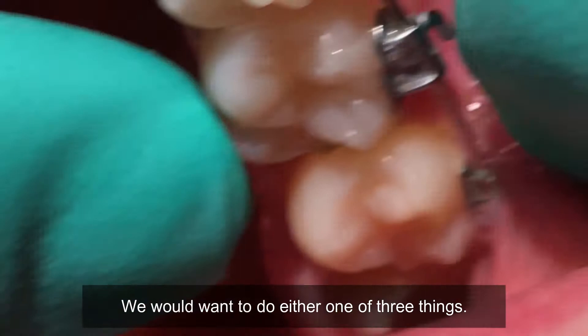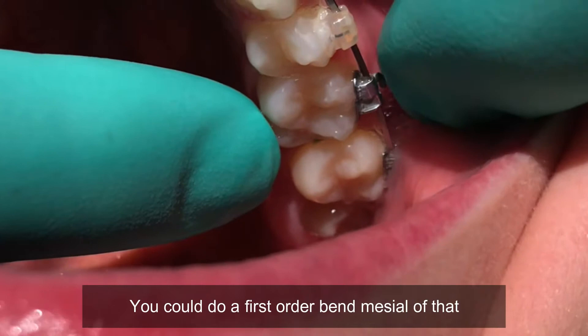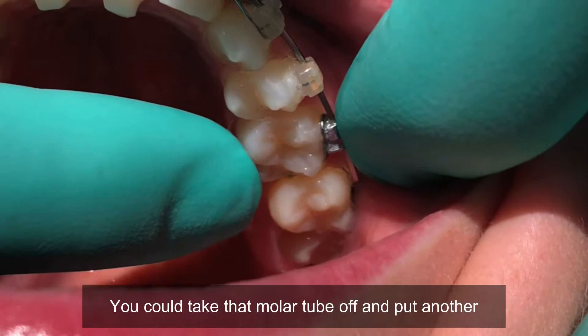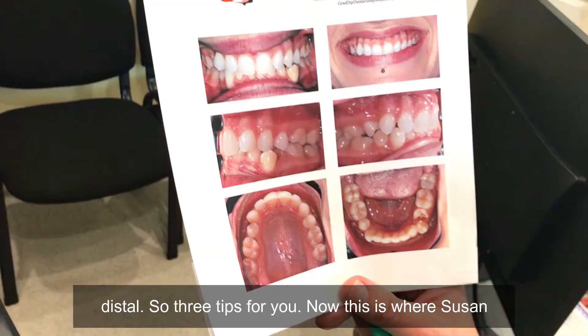We would want to do either one of three things. You could do a first order bend mesial of that molar tube, which would rotate it to match the 7. You could take that molar tube off and put another molar tube, or you can reposition that molar tube more distal. So three options for you.